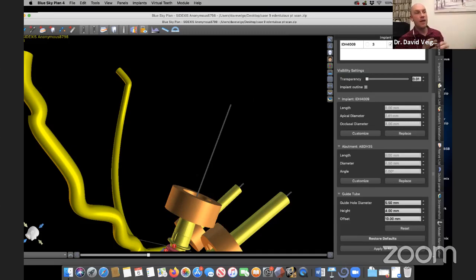So I use a material to pick up the temporary cylinders. It's called Quick Up, and it's basically just a dual cured composite resin. It comes in 2 different colors, tooth colored material and also pink material. And it comes in just an applicator. You syringe it out around the multi-units, try to get all the way down to the bottom of the multi-unit and syringe it all the way up. It comes with a nice, very delicate little applicator to put it down into it. And then once it's all set, I then take it all off. And if there's any areas I need to revise or refill in, I do that.